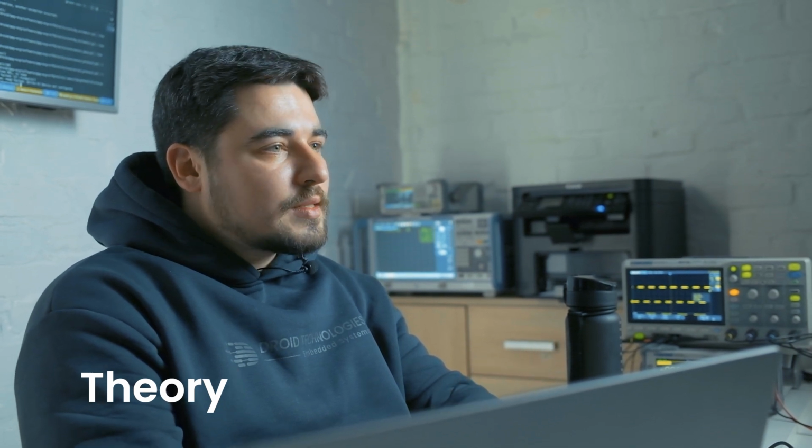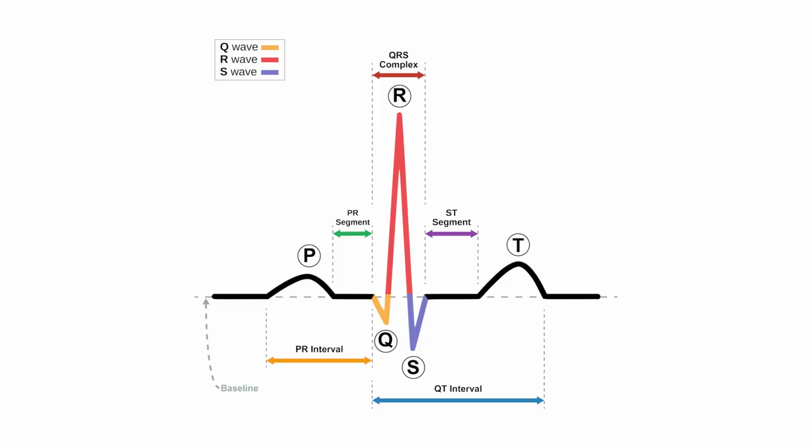Electrocardiography is used to help diagnose various heart conditions such as arrhythmias, heart attacks, pacemaker functions, and heart failure. In this image, you can see a segment of heart activity recorded by an ECG sensor.